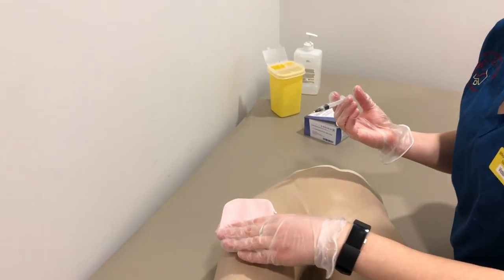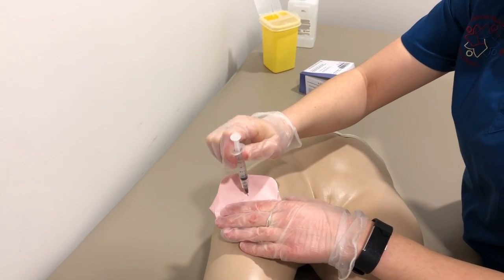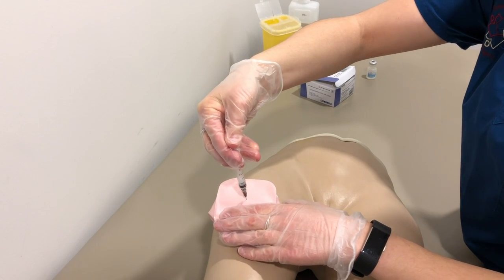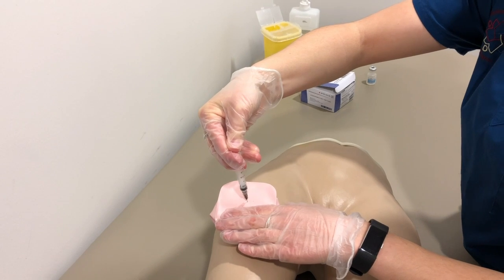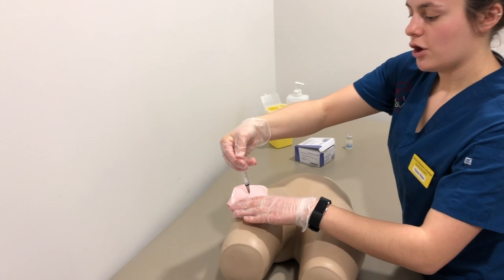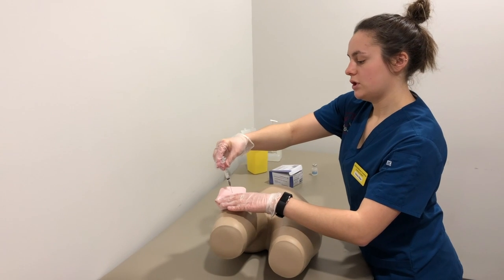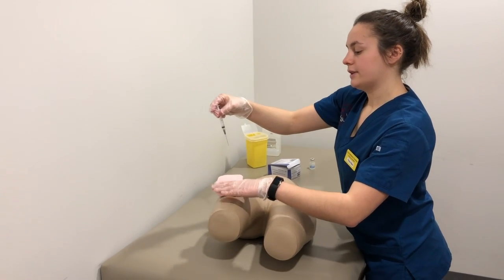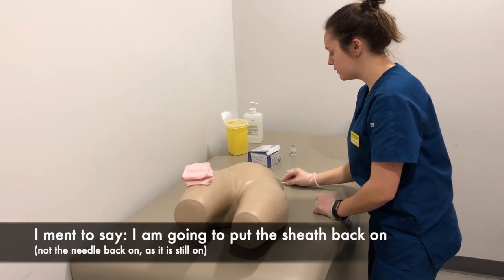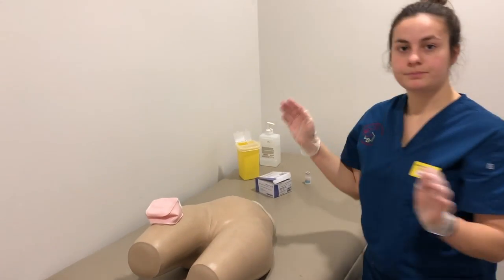I'm going to pull the skin out of the way to make the Z-track pattern and inject downwards into the skin. I'm going to put the injection in slowly but not too slow, and then you'll leave the needle in for about 10 seconds. This helps to ensure that all the medication is absorbed and does not leak back up. You're going to remove the needle, and you can let go of that skin. That ensures that the Z-track happens. I'm going to put the sheath back on and dispose of it into the sharps container.